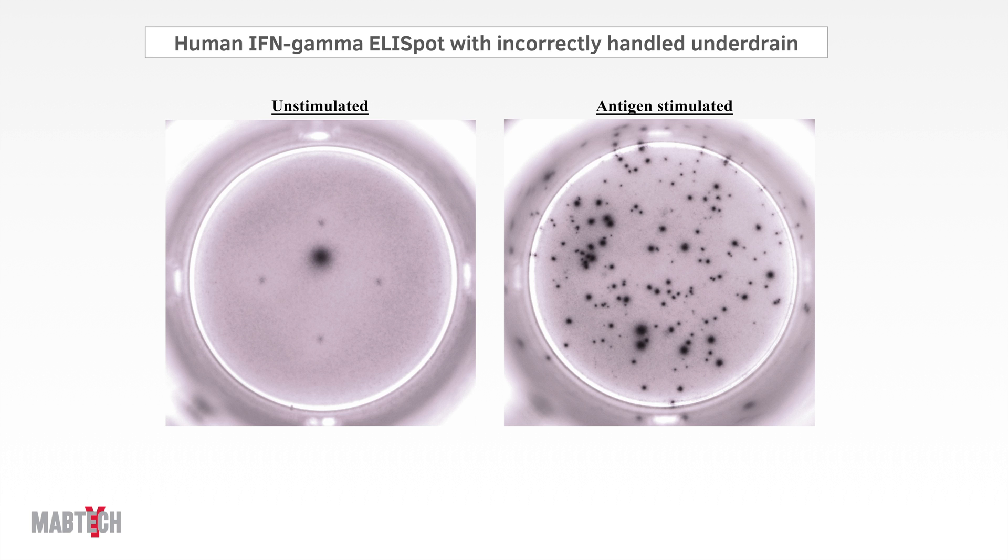In the unstimulated control to the left, the artifacts are very obvious, but you can also make them out in the antigen-stimulated well to the right if you look carefully. These unspecific dots will get counted by most readers at a low setting, and as a result, the user must spend several hours manually deleting them. Very tedious work.